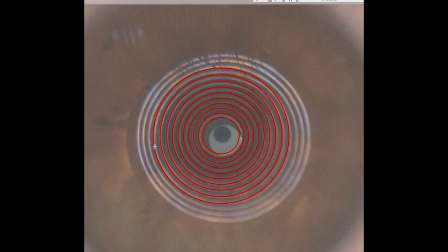And as we follow one of these white rings around, if we follow it around vertically, you see that it comes in, okay? That's both on the top and at the bottom. And then again, as we follow them around horizontally, they're pushed back out. So we can tell that this is a cornea that is flat horizontally and is steep vertically.